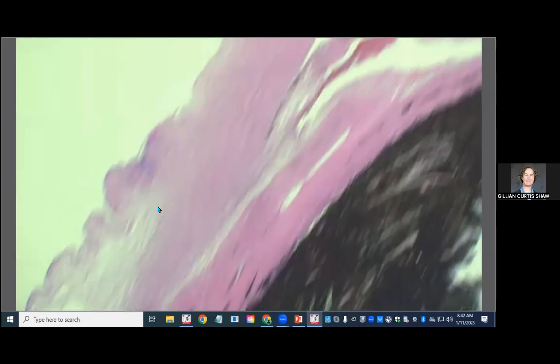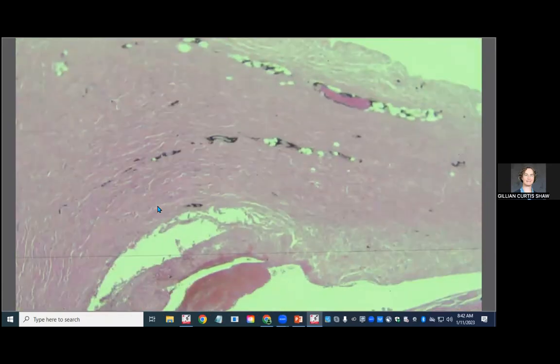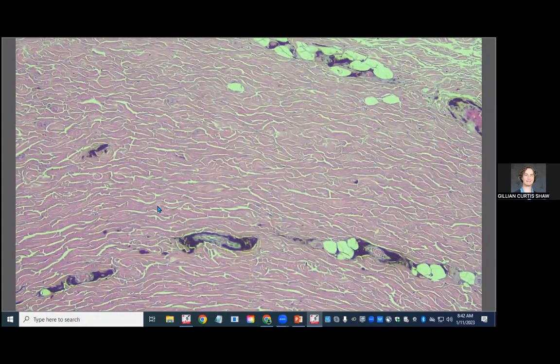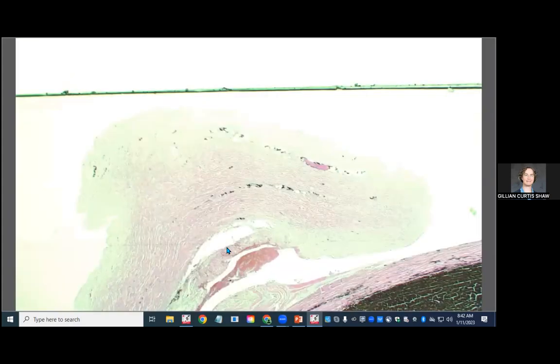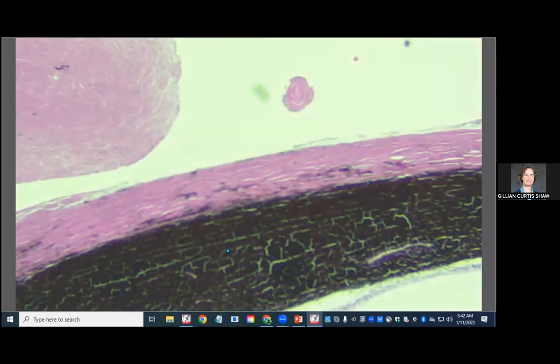Then we're going to zip over to the other side. There were some brown speckles in the gross photo up over here. And we can see that there are some melanin-containing cells alongside blood vessels in this subconjunctival or substantia propria or episcleral tissue. So this is an increased number of melanocytic cells than would normally be expected in the periocular connective tissue.